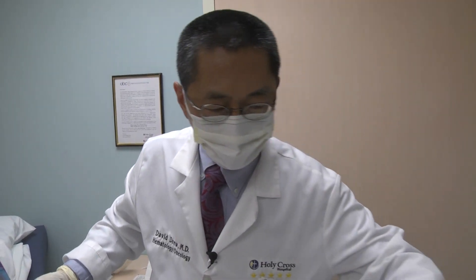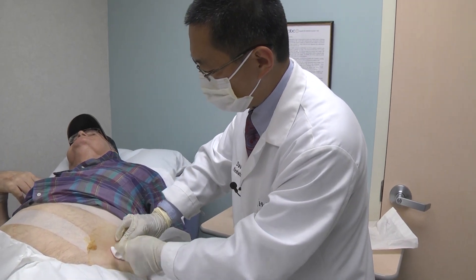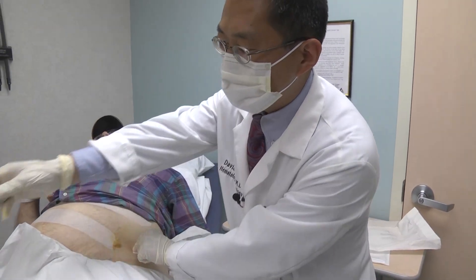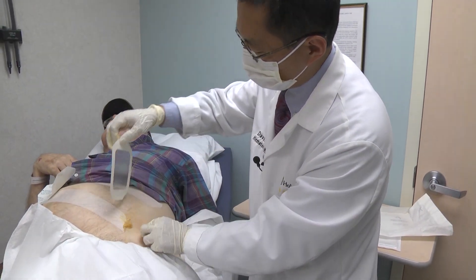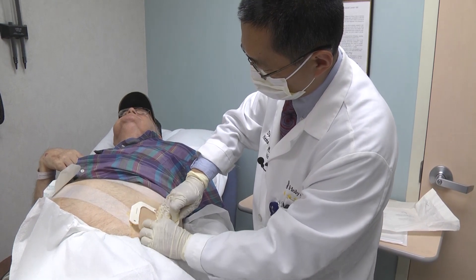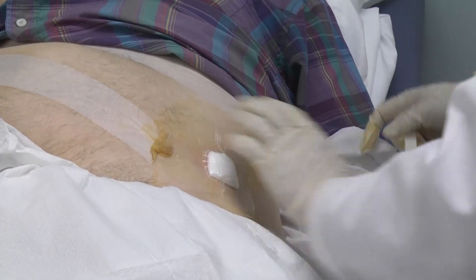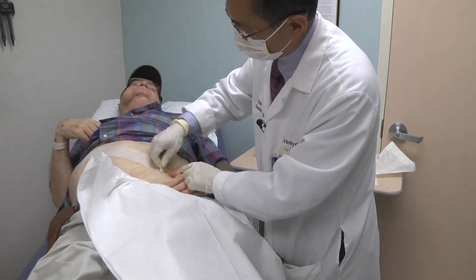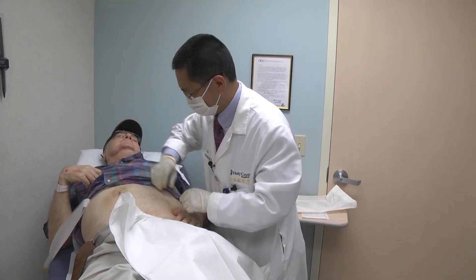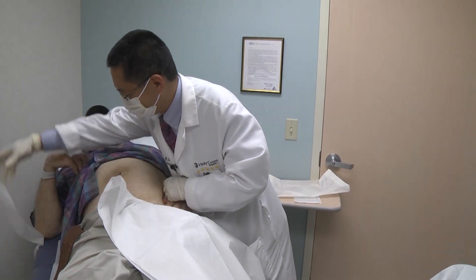It's Tegaderm. Usually I want to put a small tension band over here, then Tegaderm on top. Different people have different preferences. Can you give me your hand? Put your hand over here, and I will take away the instant tummy tuck.